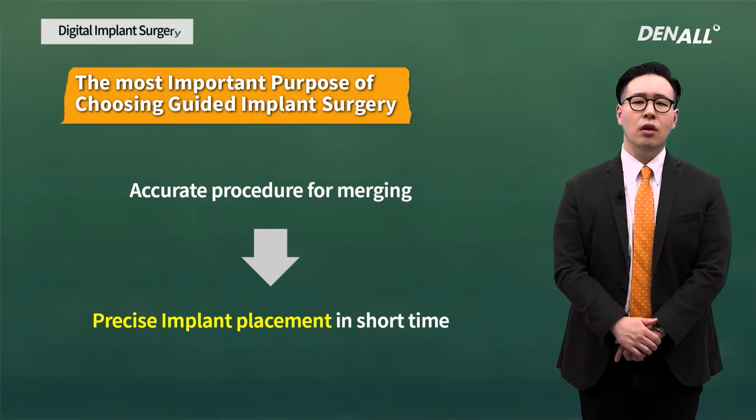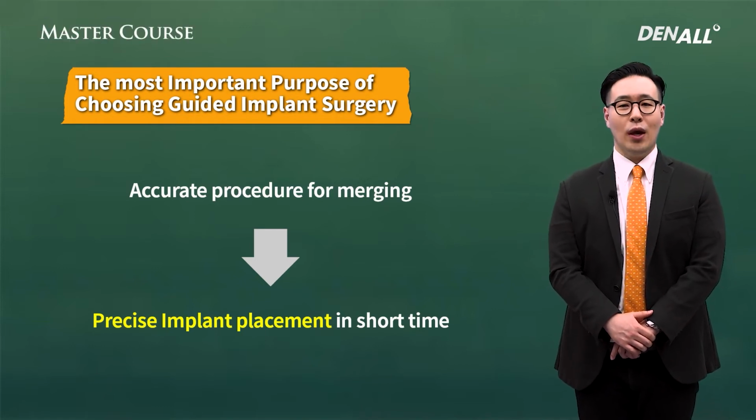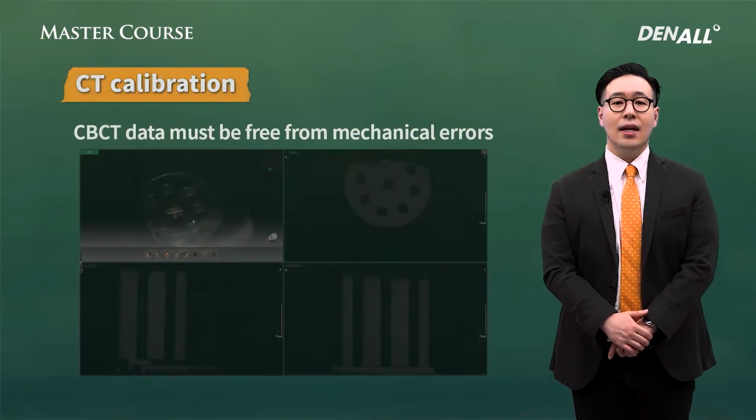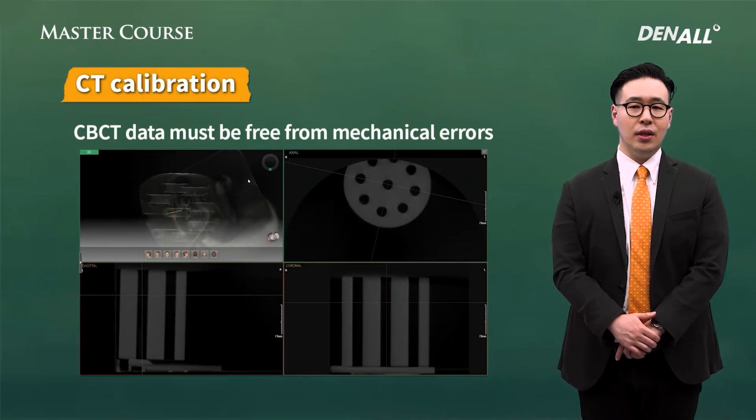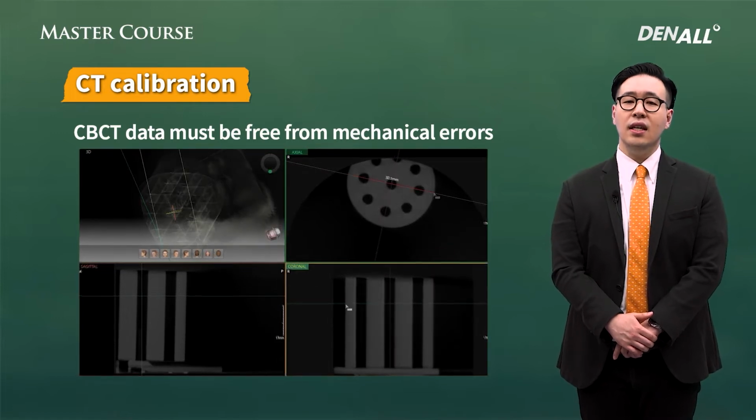For anterior implant surgery, I prefer to use digital one-guide surgery. Most importantly, the data should not have distortions. To fully embrace guided surgery, first, CBCT calibration should be done to heighten the accuracy and quality of CT data.